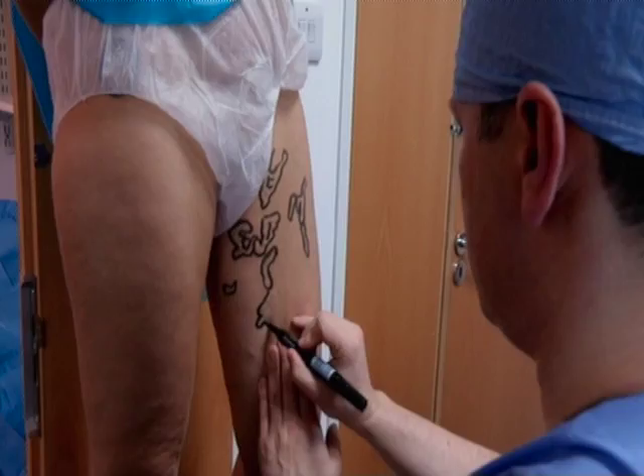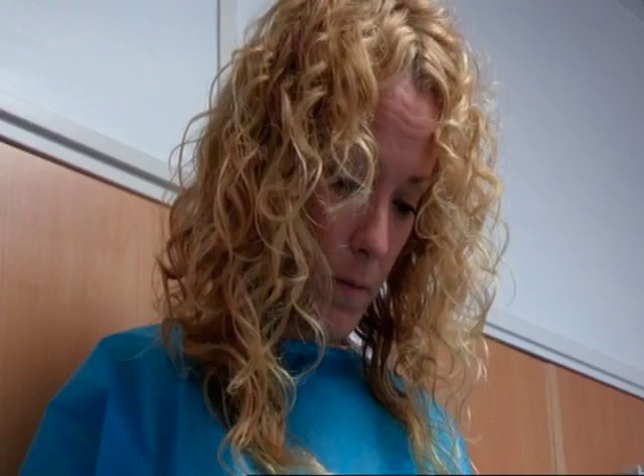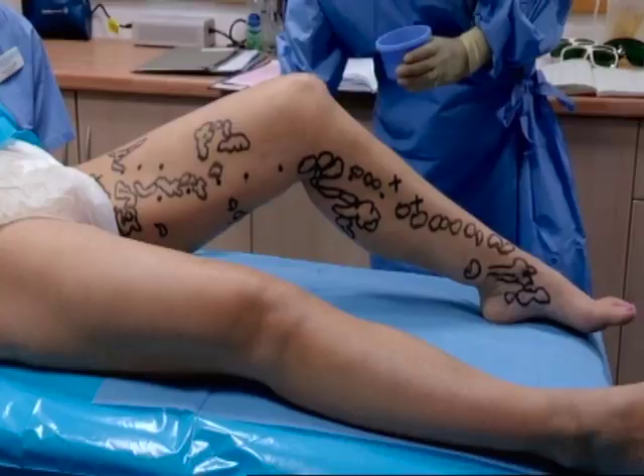But she still needs to get her legs sorted, so it's back to the Whiteley Clinic and laser surgery with Mr Mark Whiteley. He's just marking the veins on the surface, and it's only when he finishes marking her up that you get a real sense of Donna's problem. This lady has got three different veins coming from the groin down the leg that need to be lasered, and one at the back of the leg.